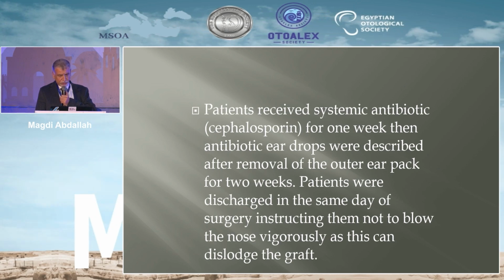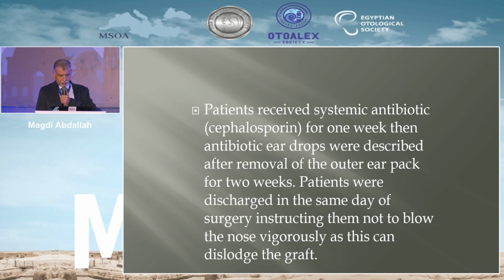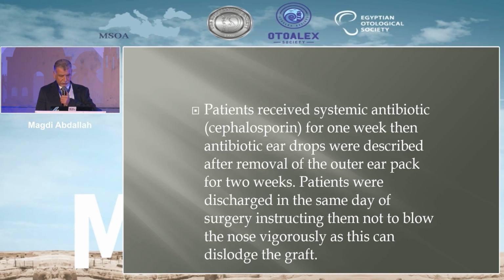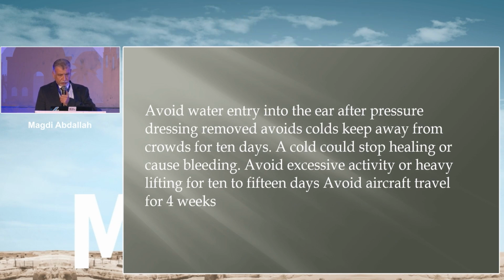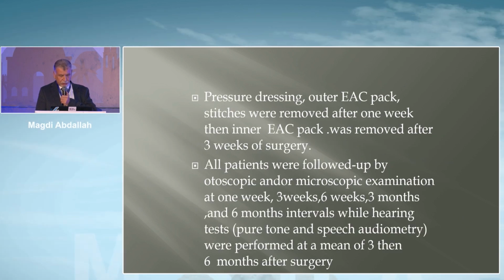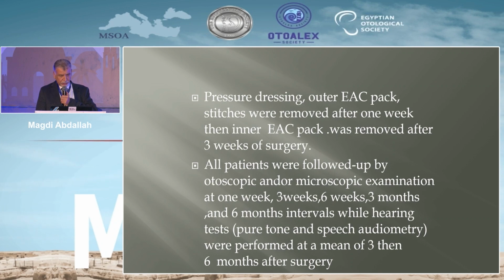The patient was discharged on the same day. The surgeon instructs the patient not to blow their nose vigorously, as they can dislodge the graft, and to avoid water entry into the ear. All these precautions must be taken into consideration.